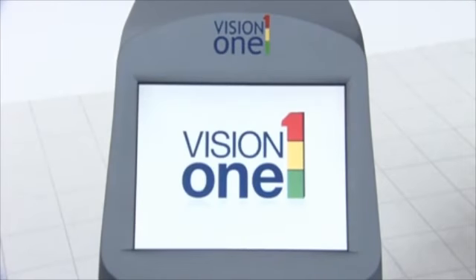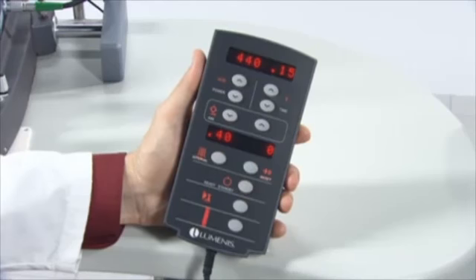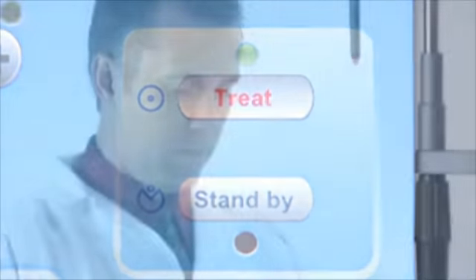When the laser is powered on, the laser emission indicator displays on the control screen to provide visual warning that laser energy is accessible. The indicator continues to display until the laser is powered off. When the remote control is connected to the laser, the ready standby selector illuminates to provide an additional visual warning that laser energy is accessible. During treatment, treat displays on the control screen and illuminates on the remote control.